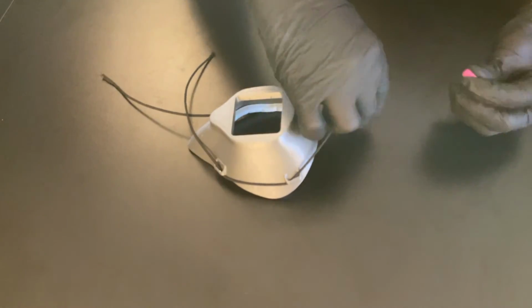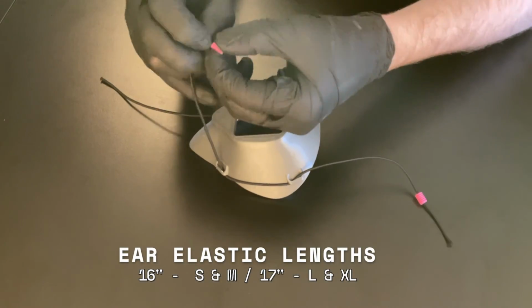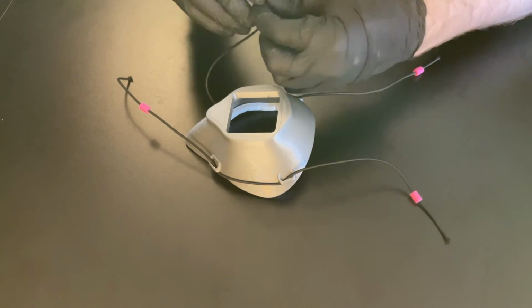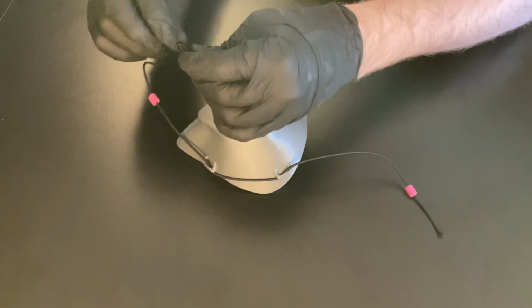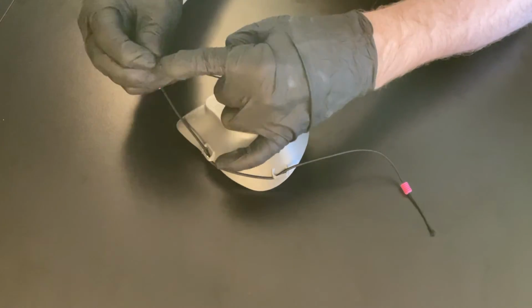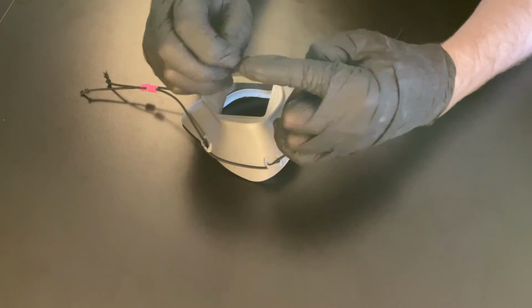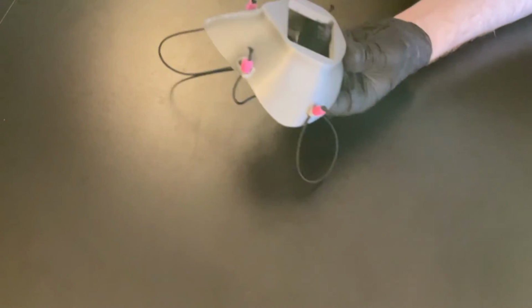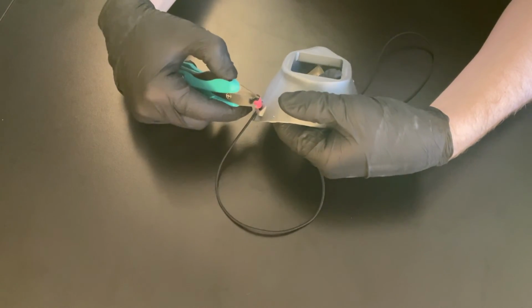Fold the loose straps over the brackets. Once each end is inserted, tie a double knot approximately 10 millimeters from the end. Trim frayed elastic edges of ear bands with sewing scissors to produce smooth edges.